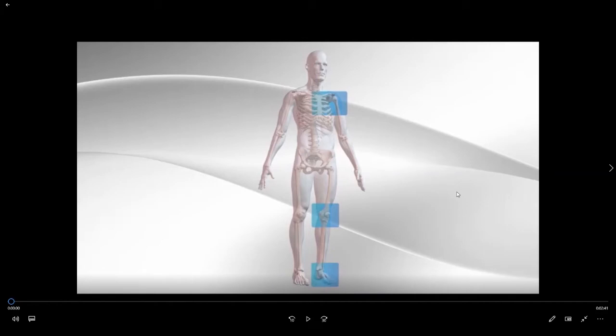Hello and welcome to another edition of the orthopedic sports medicine patient educational series with Dr. Adam Juracki. In this video we're going to go over the specifics of the surgical procedure to perform an ACL reconstruction.